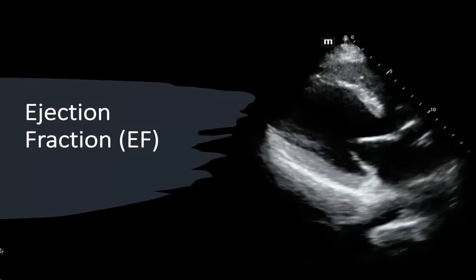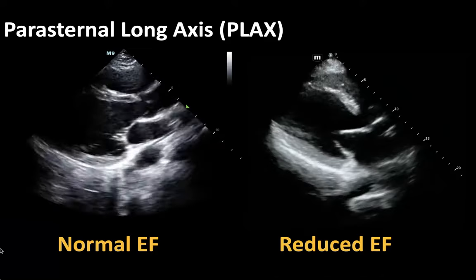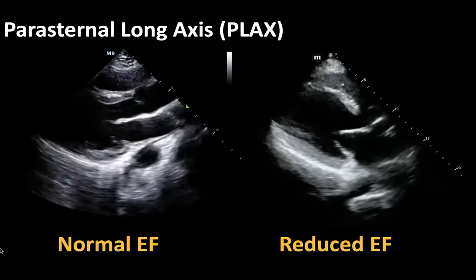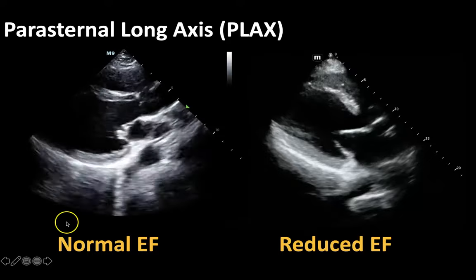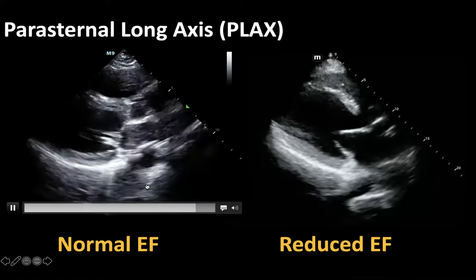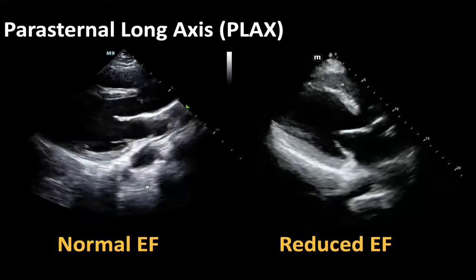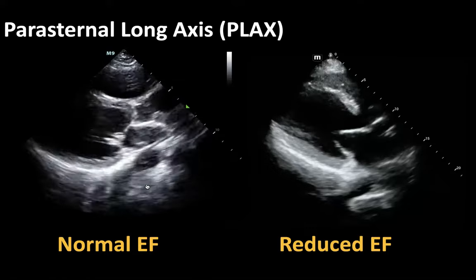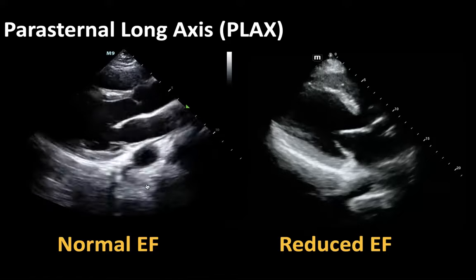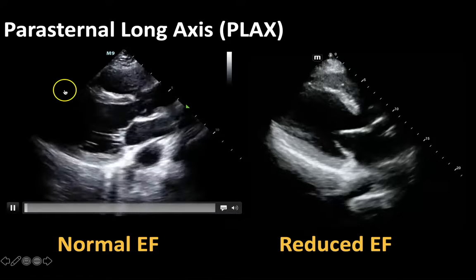So let's dive right into it. When we look at ejection fraction, we're really just looking at how well the heart is squeezing. As a refresher from the last video, we'll go through what we're looking at one more time. This heart on the left side of the screen is going to be a parasternal long axis view of a heart with a normal ejection fraction. Your parasternal long axis view is obtained with your probe at a diagonal plane to the left side of the sternum, with your probe marker facing down towards the apex of the heart.